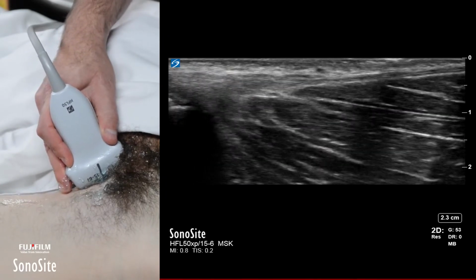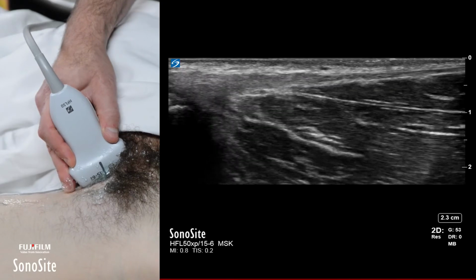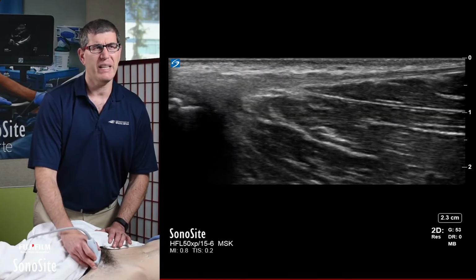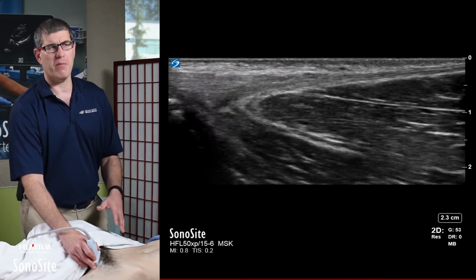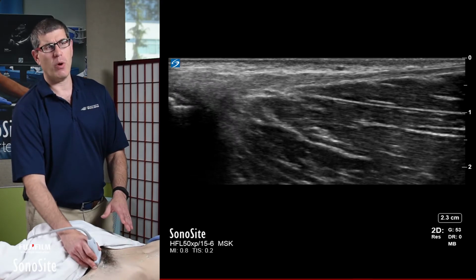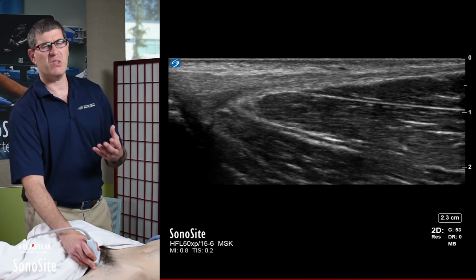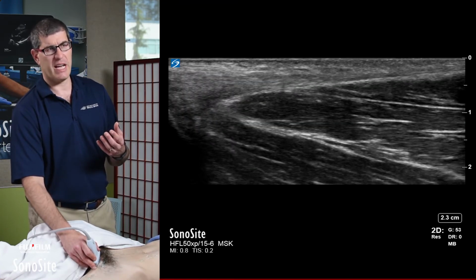So here on the screen, you can see that hyperechoic tendon on the left. You can see a little bit of the pubic tubercle, and you can see the muscle. Right at that junction point, you may see different examples of myotendinous junction injury. The one that would be the most acute would be a hematoma formation, where you may see some hypoechoic fluid developing between where the muscle and the tendon attach.